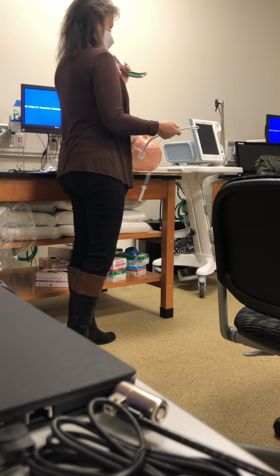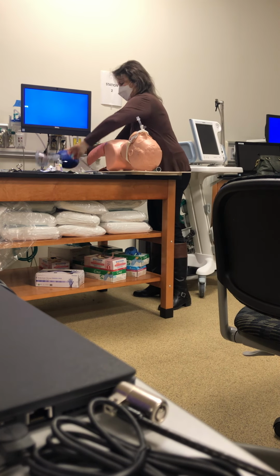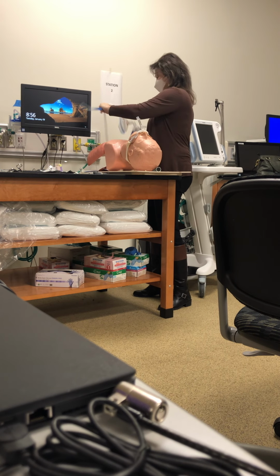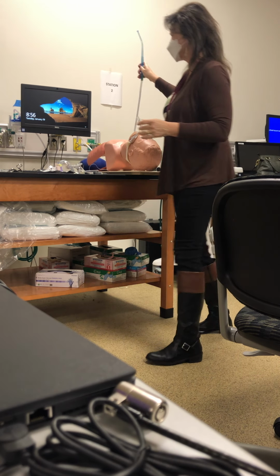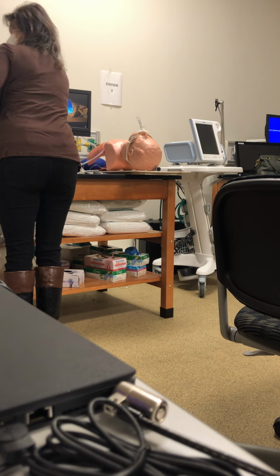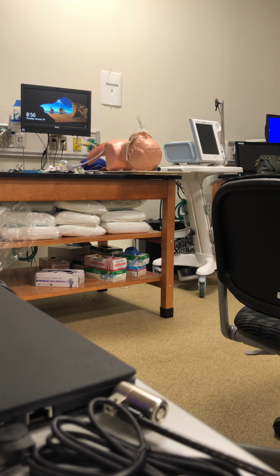So now I've got this, I've got my suction ready. And what should my suction be set at? What's normal suction pressure? And you want it on regular, not intermittent. 120? What's the range? 150, right? 120 to 150. So I'm at 140. Am I good? You want to check your suction.